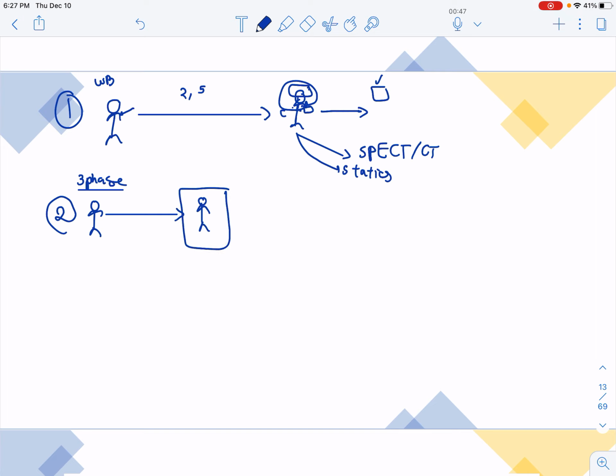If we want to image the hand or the feet, it depends which area we want to image. We set the camera and position the patient, and we inject the patient. Once we give the injection, we start the imaging. Why are we doing that?